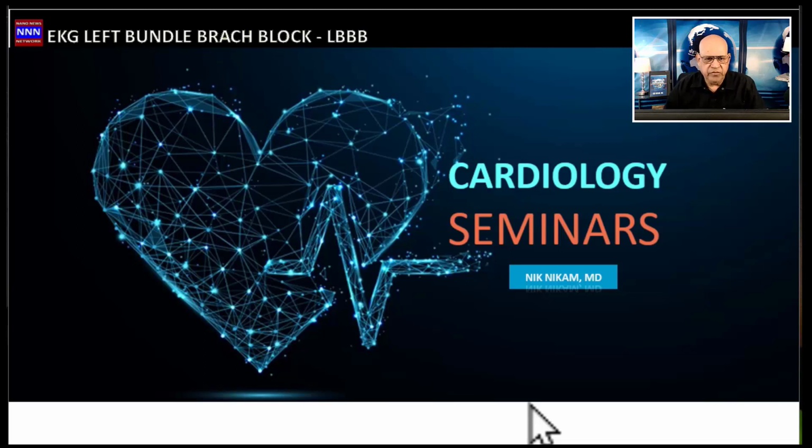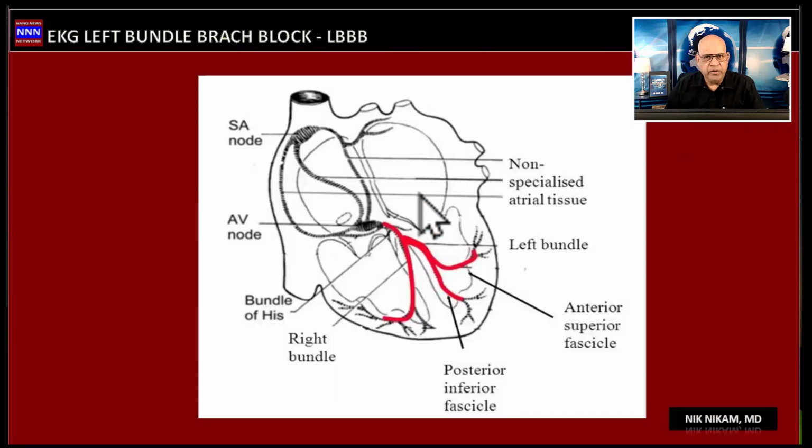In this presentation, we are going to look at left bundle branch block, commonly known as LBBB. So let us begin with the topic. Before I go into the electrocardiographic features of a left bundle branch block, I would like to brush up upon the electrical system of the heart.